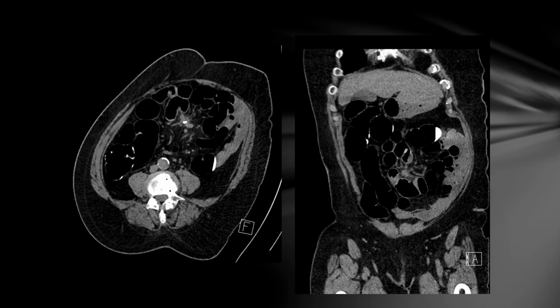We often don't see the small bowel tumour. They can be tiny. So sometimes we can see this kind of mesenteric mass, and we can't on CT find the small bowel tumour because they can only be 3 or 4 millimetres big. And when the bowel is all collapsed, there's no gas in the bowel normally on a normal CT scan, so you can't really tell the normal bowel wall from a tumour.